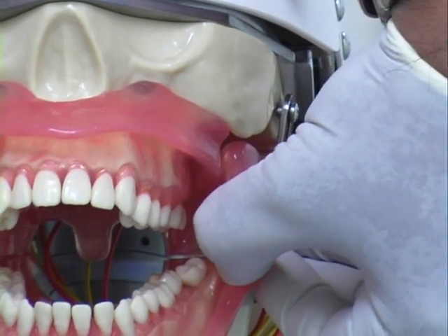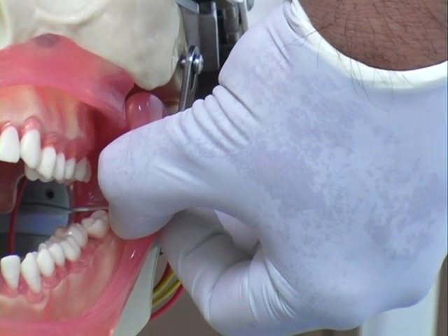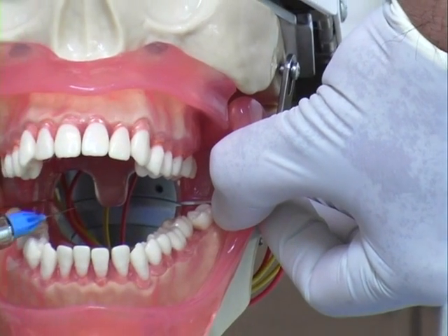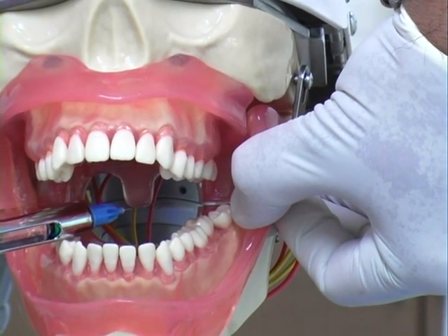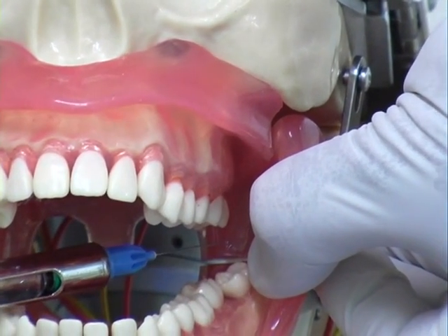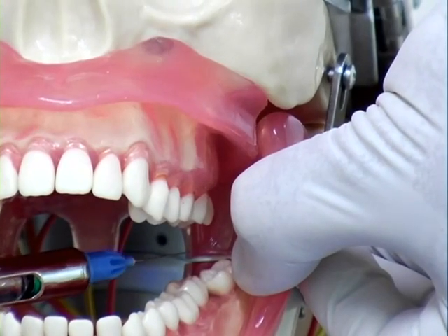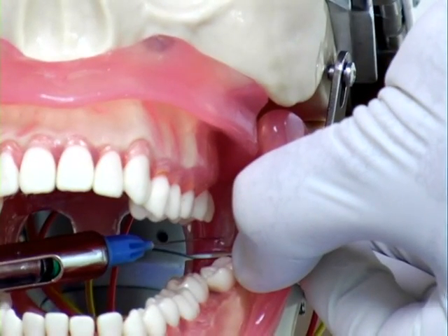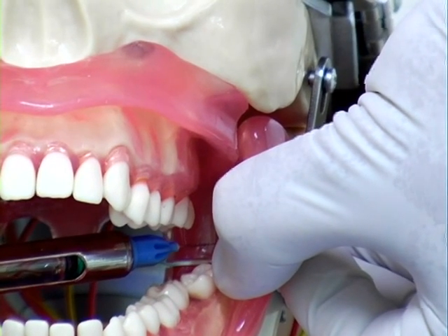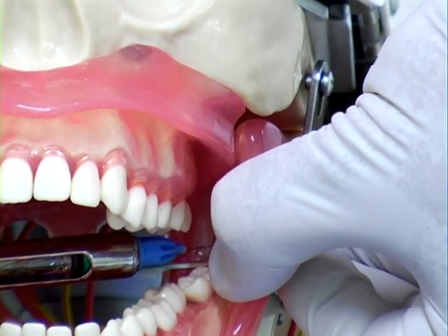Here you can identify the coronoid notch where the finger or thumbnail should be placed, and while the barrel of the syringe is lying on the opposite side of the premolar, you can have an injection point 5 millimeters medial to the coronoid notch and about 1 centimeter above the occlusal plane. You advance the needle until either you touch the bone or up to 25 millimeters depth.